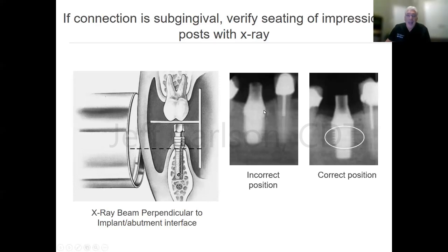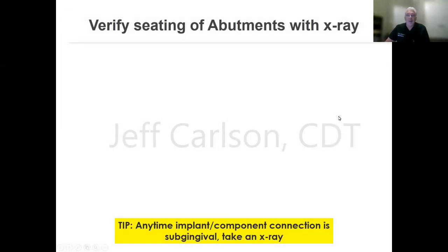But here's my point. If the threads are blurry, you cannot be certain if that abutment is completely seated. This happens to be completely seated because the threads are perpendicular, the threads are there, and you see no gap here. As opposed to this.